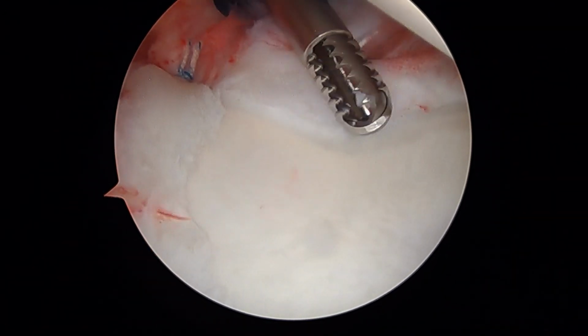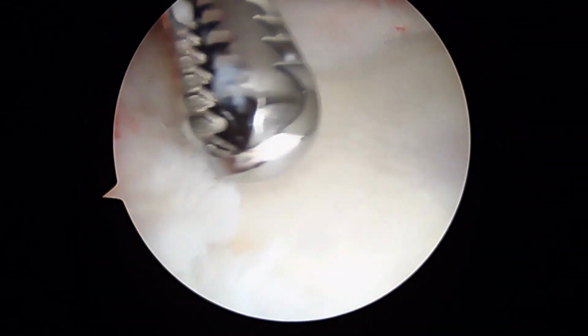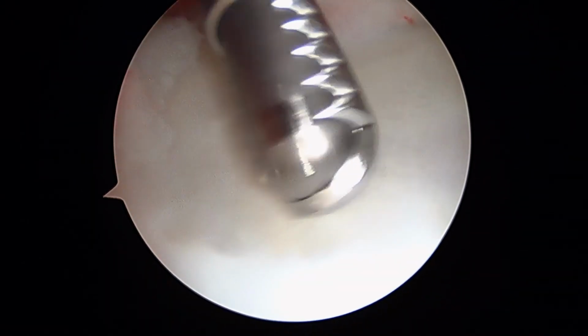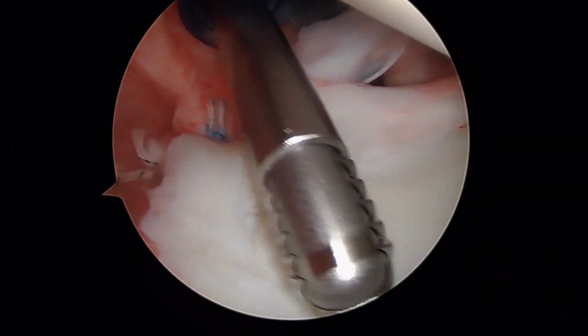So I think that's better. I was worried about the stability of the labrum, and having those two sutures in makes me feel a bit better. Hopefully it does better for you clinically too. This is going to be the end of the video because everything else we do is outside the shoulder joint.